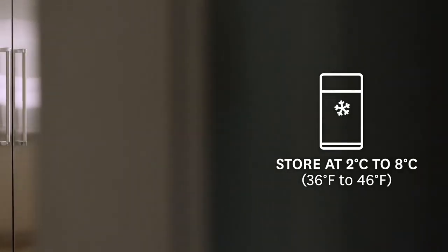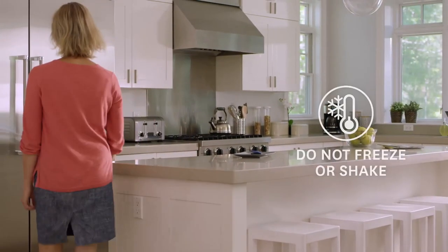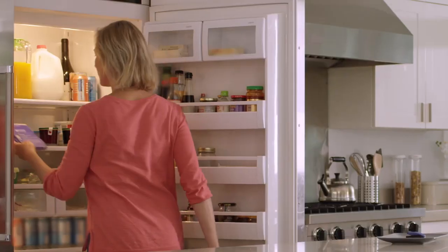When my shipment arrives, I put them right into the fridge in their original carton, as Kinneret must be refrigerated and protected from light. Don't freeze or shake Kinneret. The dose of Kinneret for adults with RA is 100 milligrams per day — that's one full syringe.